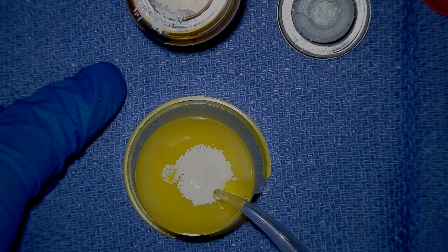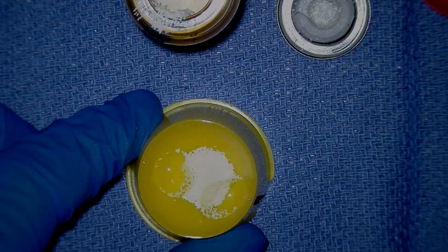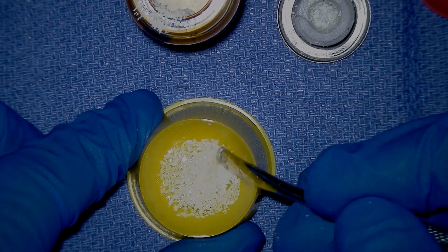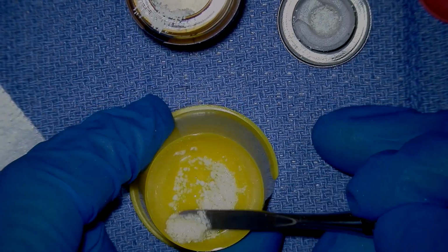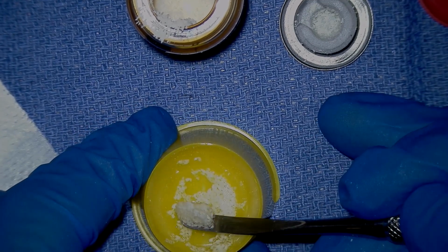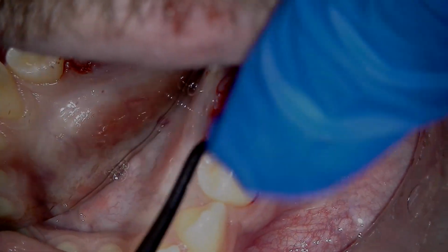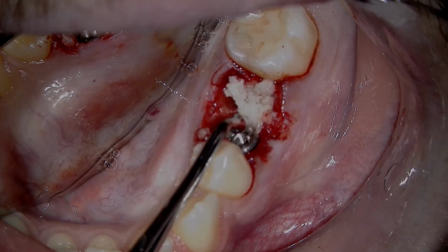And I'm trying to go for a working consistency where the bone will basically stick to my instrument. So I'm going to mix this around and play with it a little bit in the dampened dish until I find the consistency that I like. Now if I add too much saline, I can wick it out with some sterile gauze, but roughly I want it to be able to stick to my instrument. Good consistency. It's kind of like building a sandcastle. Carry it over to the site and I will pack it in with a bone condenser.